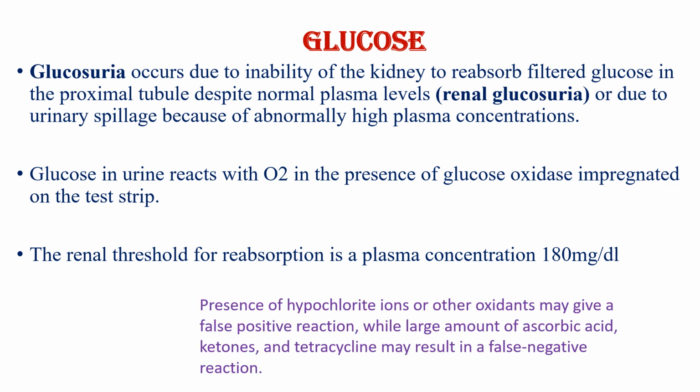Presence of hypochlorite ions or other oxidants may give a false positive reaction, while large amounts of ascorbic acid, ketones, or tetracycline may result in a false negative reaction.